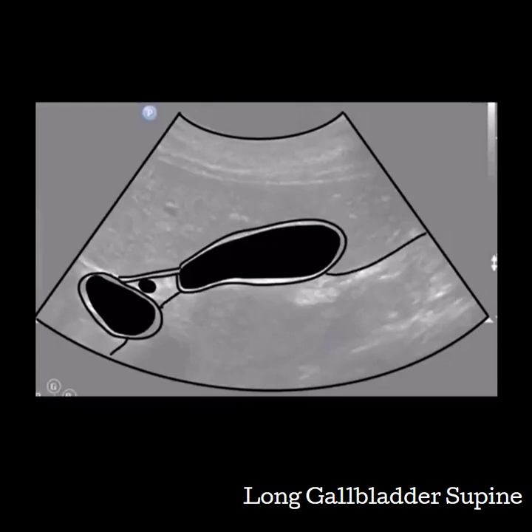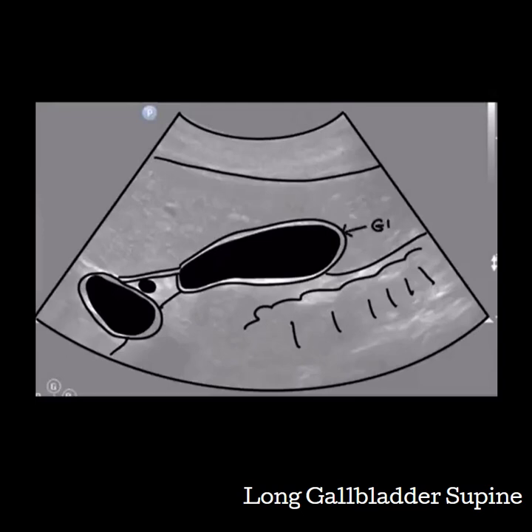The major landmarks you will see in this image include the gallbladder, the portal vein, and the main lobar fissure. You will also be able to see the liver surrounding the anterior side. You will see the duodenum on the posterior side of the gallbladder. The hepatic artery may also be visible in this image as well, as it is part of the portal triad. If you choose to measure the wall in this image, find a representative portion on the anterior wall next to the liver.